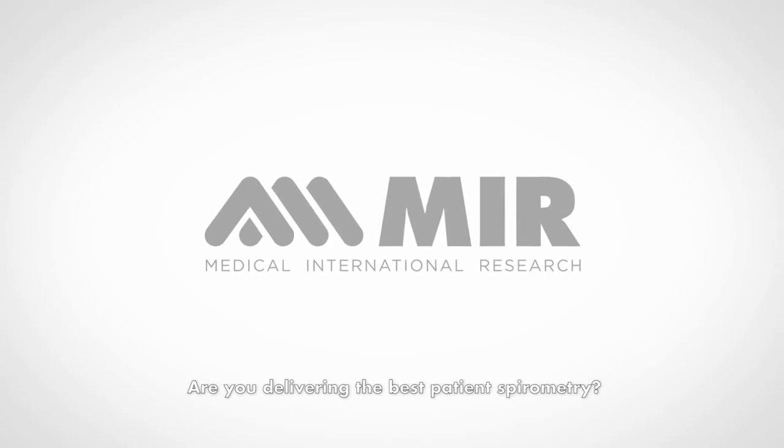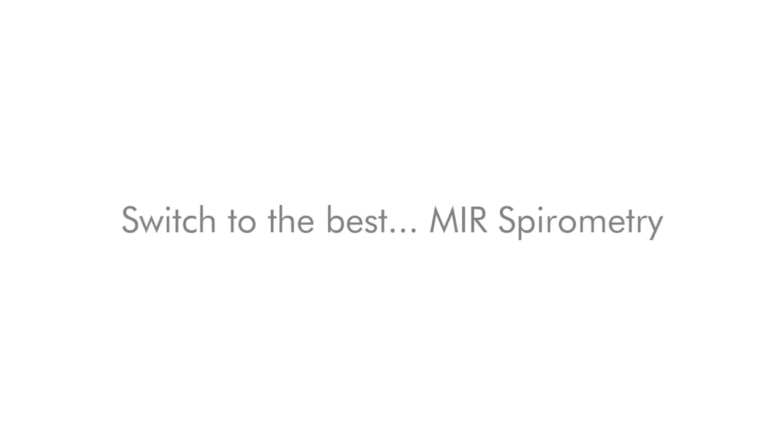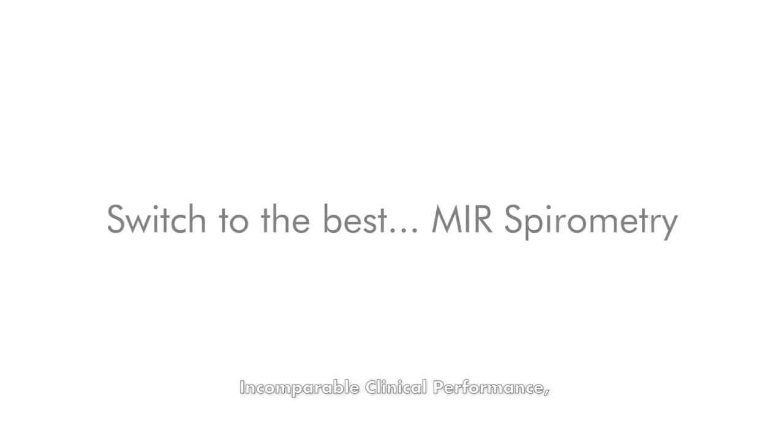Are you delivering the best patient spirometry? Probably not. Switch to the best. MIR Spirometry. Incomparable clinical performance.